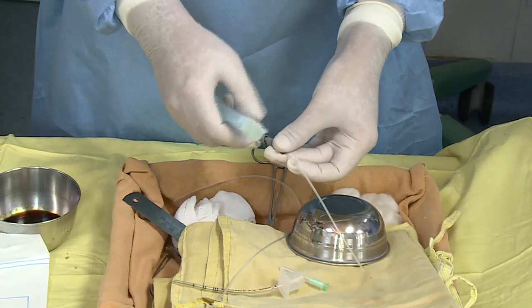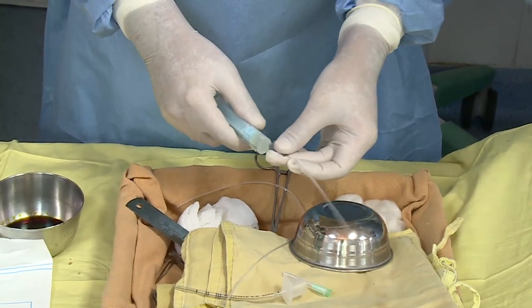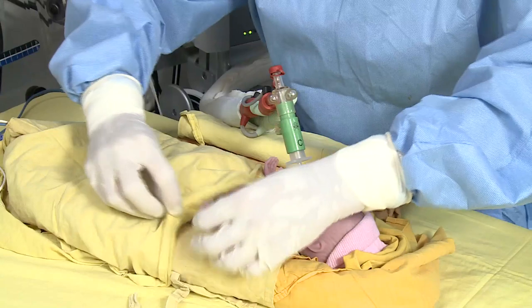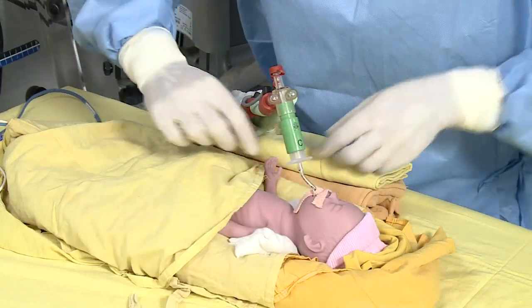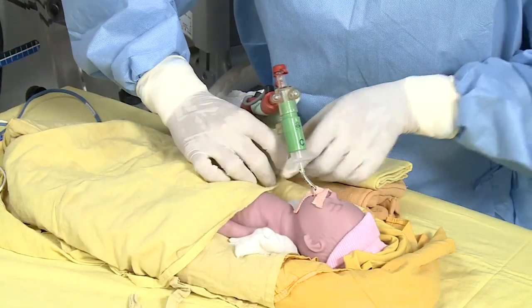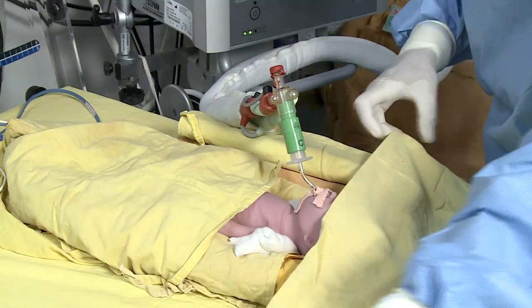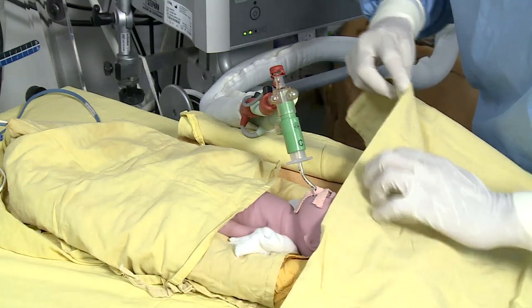Attach the surfactant-filled syringe to the hub of the orogastric tube. Keep the baby supine and do not change the position of the baby during the procedure, as change of position has not been shown to influence the efficacy.